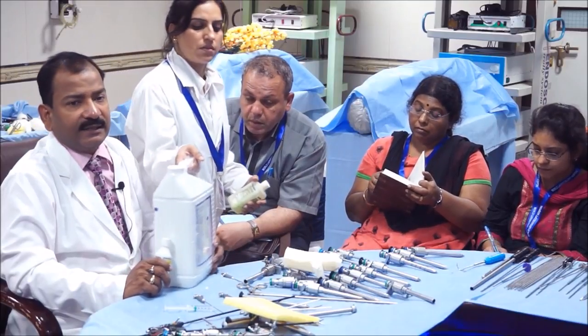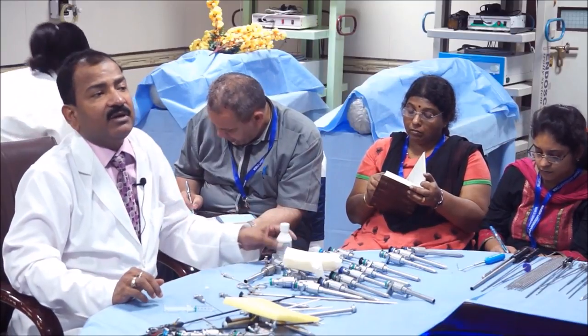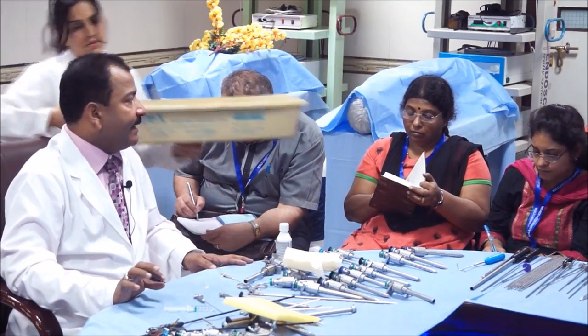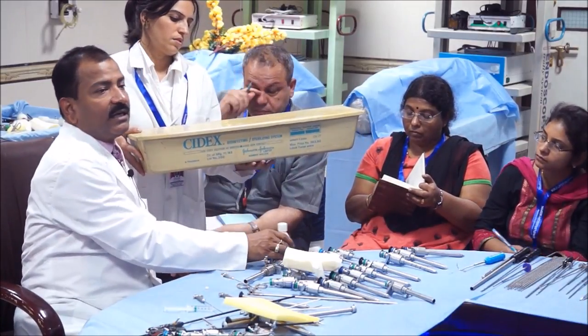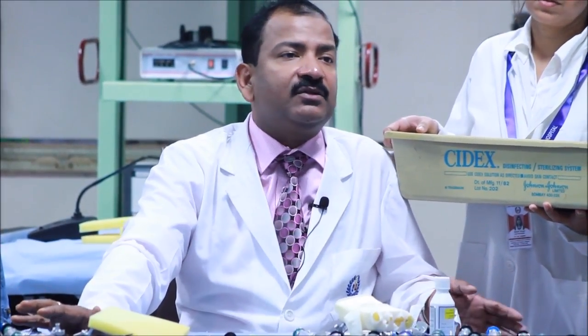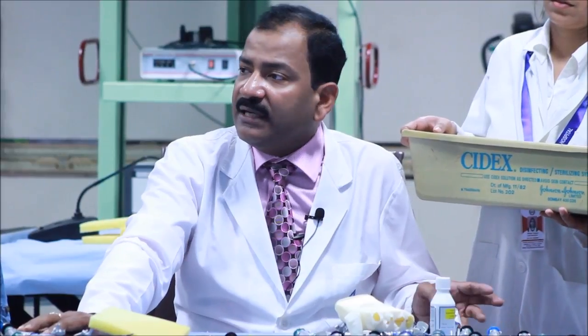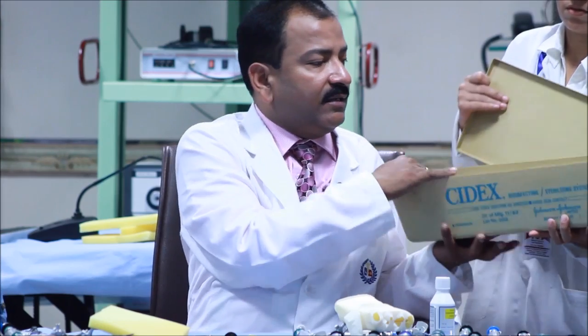There is one Cidex tray. In that tray you have to keep this instrument for 6 to 8 hours if you want to sterilize. And here you have to write the activation date and expiry date. Once activated, it can be used 15 times or 15 days, whichever comes earlier. Like if in 3 days you have cleaned surgery, then you have to throw it out after 3 days. If 15 days there was no surgery, then also on the 16th day you cannot use the activator. It is now expired. Inside there is another tray, a perforated tray.